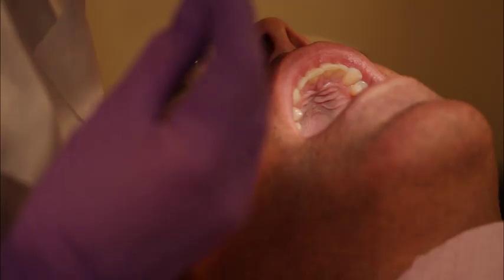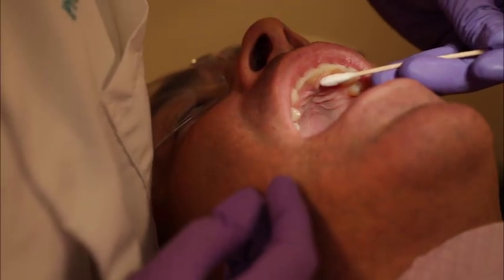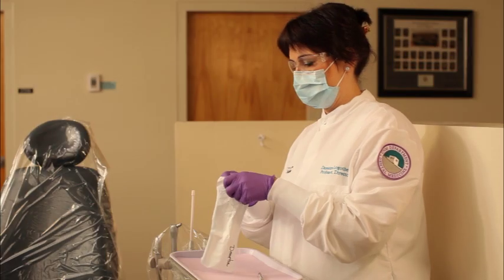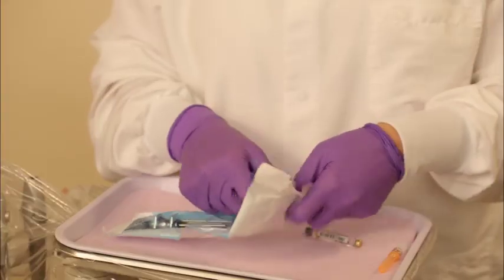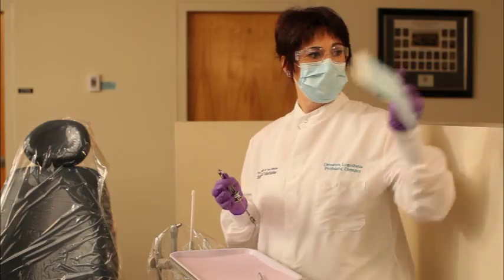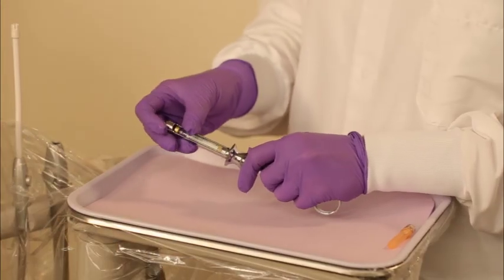Perform pressure anesthesia with a cotton tip applicator on the palatal tissue on the contralateral side of the incisive papilla. Applying pressure anesthesia with the cotton swab for 1 to 2 minutes before needle penetration will help make this injection more comfortable for the patient. Load the local anesthetic syringe as demonstrated in the procedure, loading the metallic or plastic cartridge-type syringe. Before the injection, follow all steps as demonstrated in the procedure, basic injection technique.